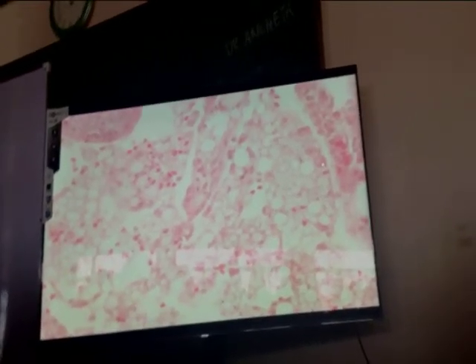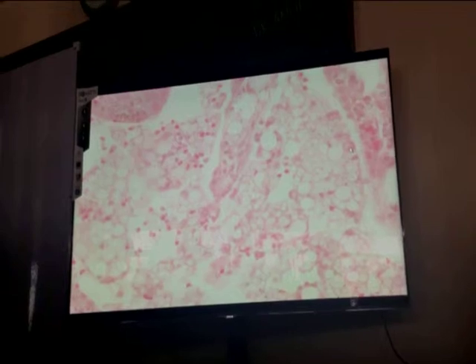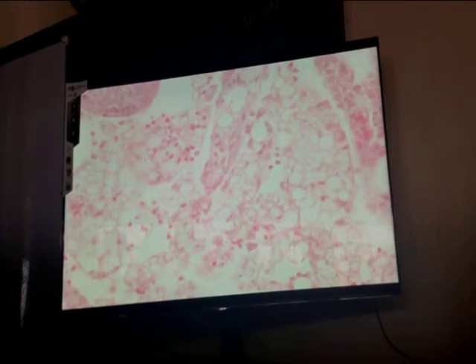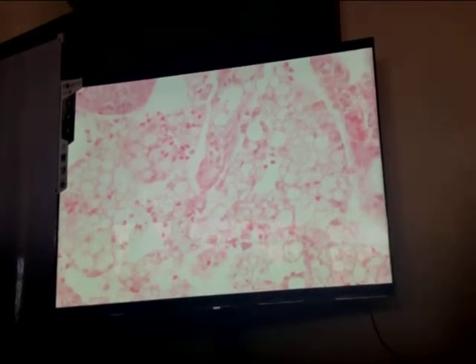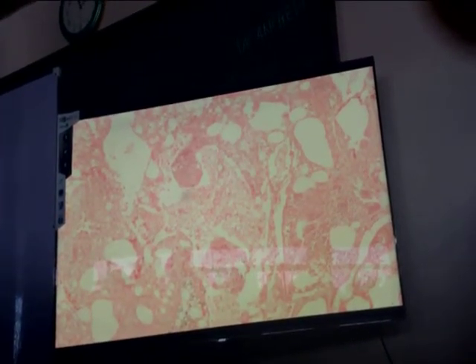fats. So mostly these fats are already inside the cells pointed. So expectedly the cells pointed should be the macrophages, engulfing these foreign bodies which are composed of lipids. So, are lipids normally present inside the alveolar spaces? No. So, this is lipid aspiration pneumonia. So, you should be able to see lipid droplets within the macrophages with an accompanying inflammation of the interstitium. So, lipid aspiration pneumonia. 135.